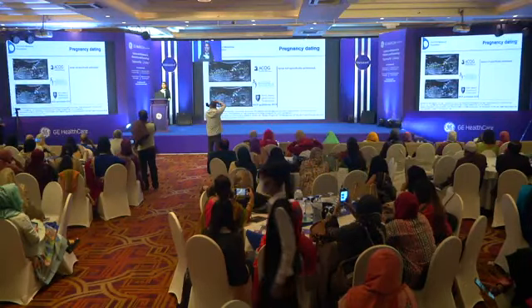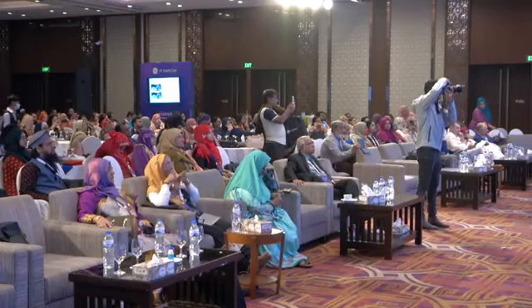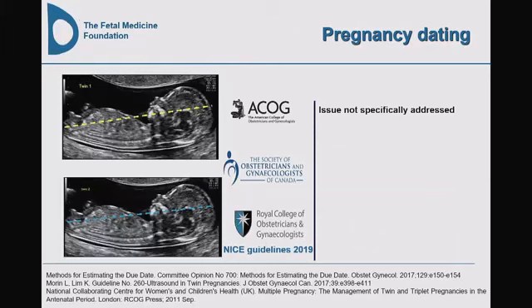Now, how do we date pregnancy in twins? Well, I will just present very briefly what we are going to discuss in the December course organized by the Fetal Medicine Foundation in London. And this is actually new research. How do we know, and what is known so far? Well, according to the different designated bodies and the different guidelines, we know that the American guidelines did not specifically address the issue of how to date twin pregnancy.